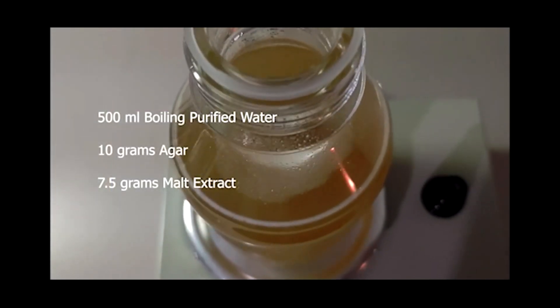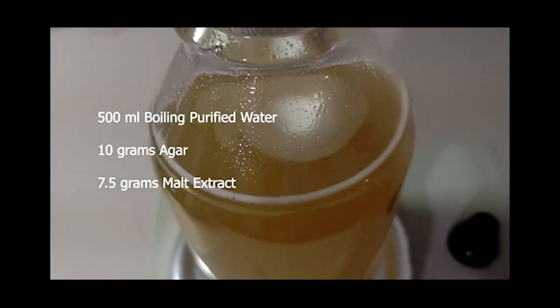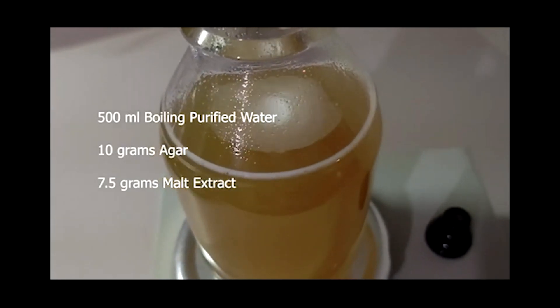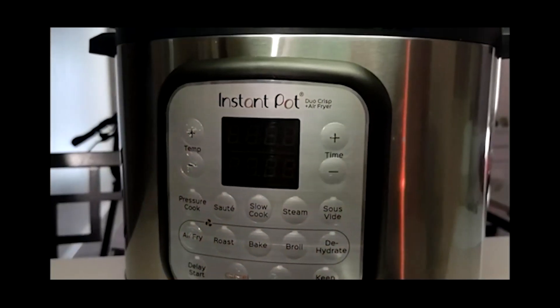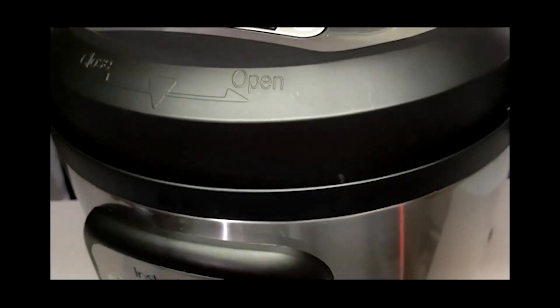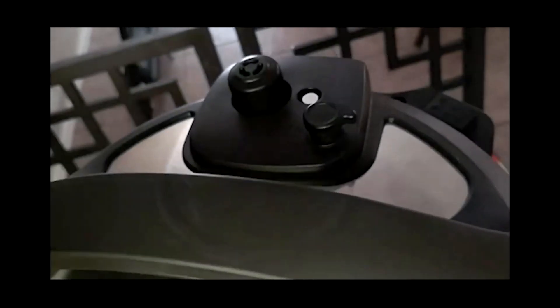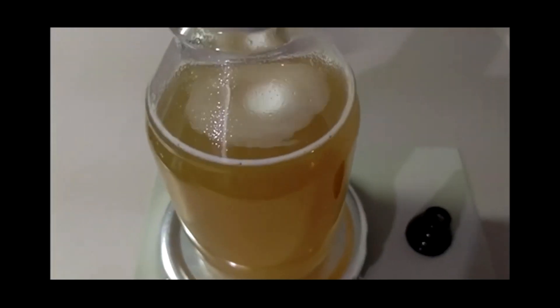Using 500 milliliters of boiling, purified, or distilled water, mix 10 grams of agar and 7.5 grams of malt extract. Pressure cook for no longer than 20 minutes at 15 PSI so you don't caramelize the sugars or overcook the nutrients. Allow the MEA to cool between 120 and 140 degrees, then you're ready to pour.